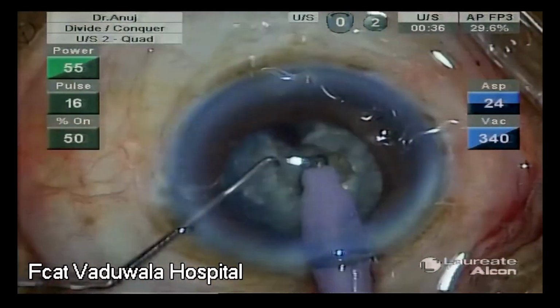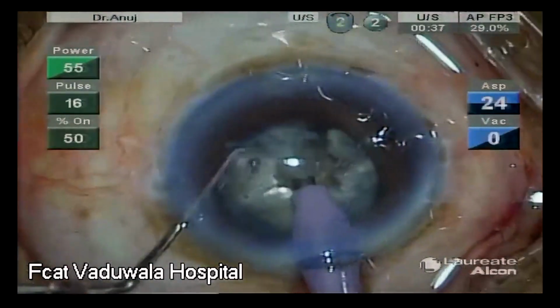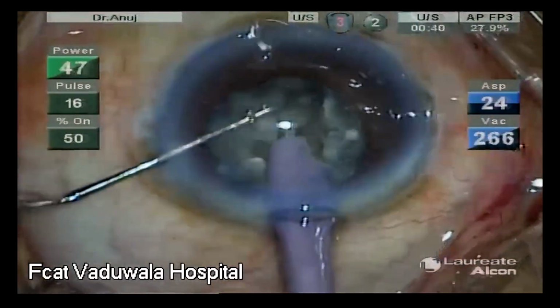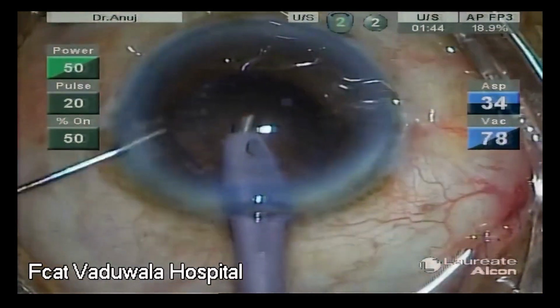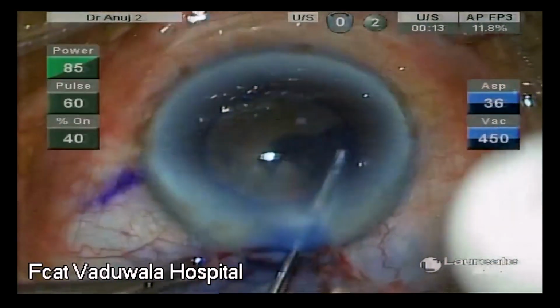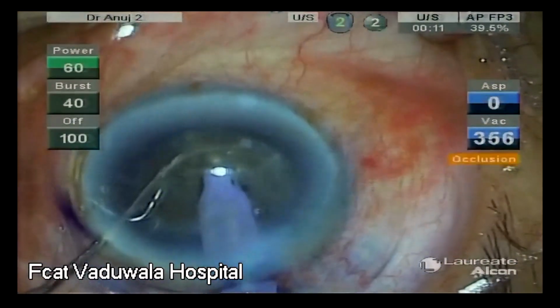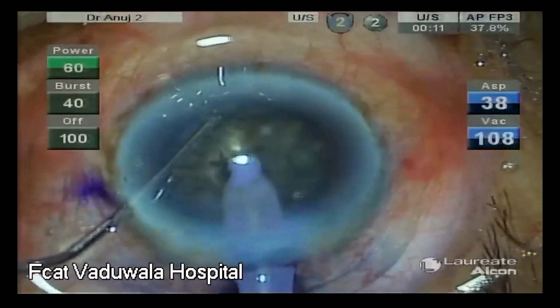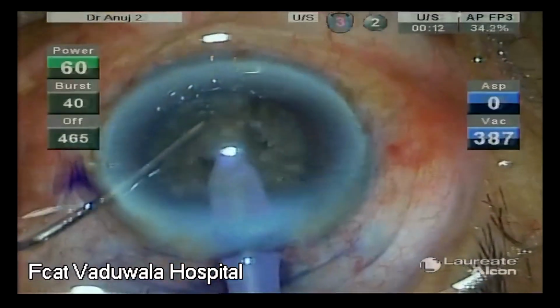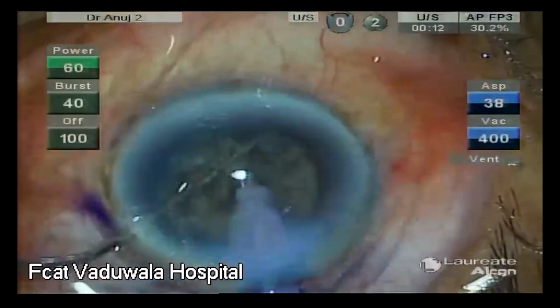of the Sinskey, where we need to separate the fragments layer by layer going into deeper planes until we see a complete crack till the base of the nucleus. This should be performed while the exposed phaco tip is embedded into the walls of the central well, reaching around 70 to 80% depth, and during the entire chop there is sufficient vacuum being constantly applied, which not only stabilizes the nucleus but also prevents it from going into the periphery, hence avoids any stress on the zonules.